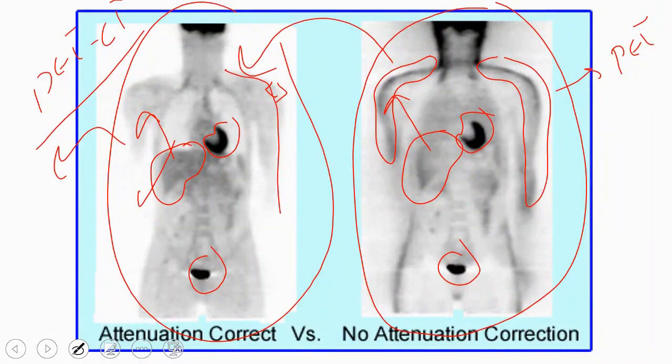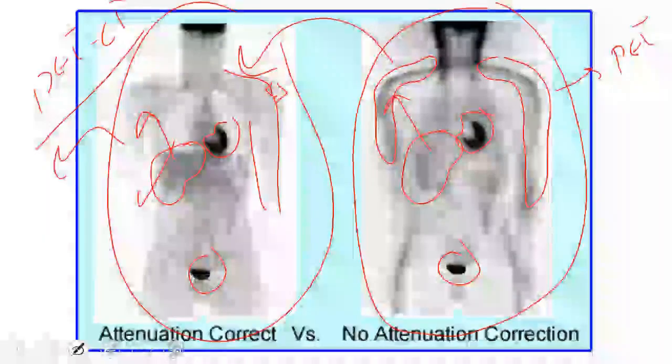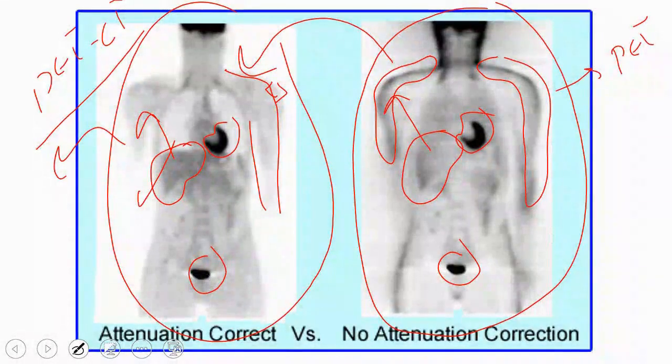The idea of attenuation correction is that you take a CT image, which is a very standard cross-sectional image of the whole body, and you see each pixel's level of high attenuation. You will add counts corresponding to the amount of attenuation. For those with low attenuation, you will subtract the count corresponding to the attenuation, thus returning the image to its true state in this way. Is that clear, doctors? All right.